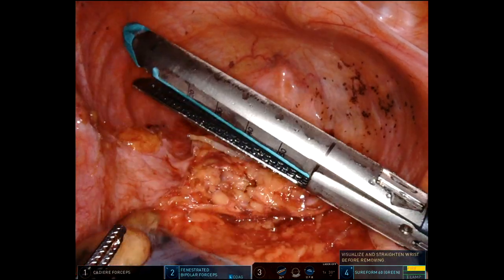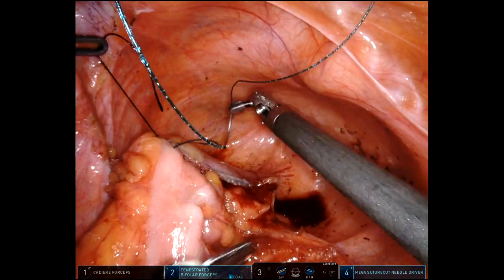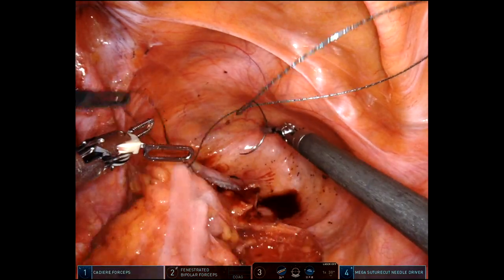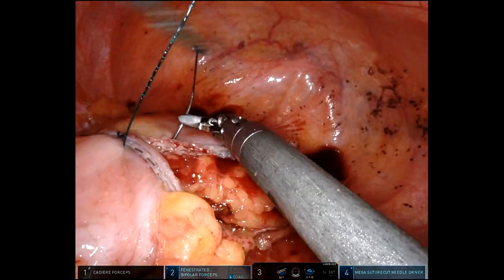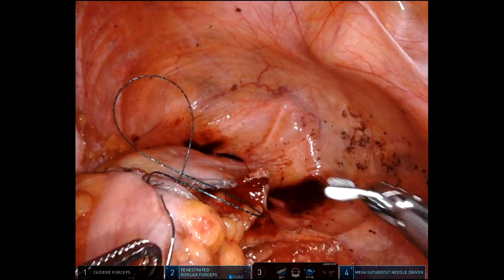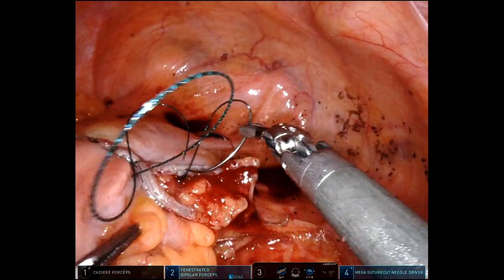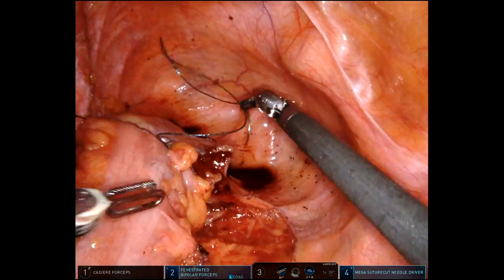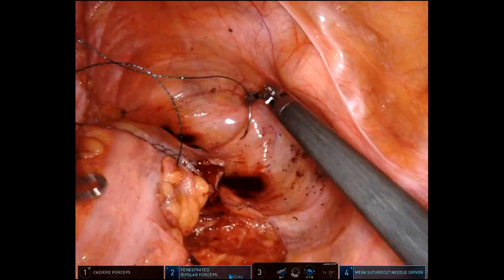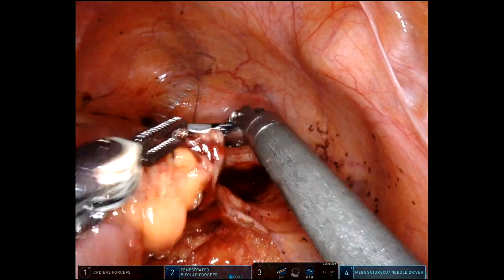I'm very happy with the flow of the case — I'm at around one hour of docked time, and now I'm setting up the anastomosis that I've come to really enjoy. I have posted on other sites within the last couple of months where I actually did need to revise the anastomosis, and you'll see why, because this is the second time that this has happened to me in several hundred of these anastomoses. This case speaks to how we should never leave the operating room until we are 100% satisfied with how things look. Don't put the patient at risk for things we know we can do better.